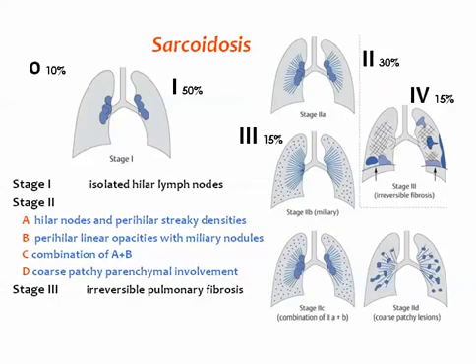Then we came to sarcoid. Sarcoid has many different classifications according to the grades. Some classifications include grade 0, 1, 2, and so on, and other classifications include stage 1, stage 2, A, B, C, and D, then stage 3. Don't bother yourself. If you see lymph nodes only in the chest, bilateral, symmetrical, they are called potato lymph nodes, then you consider this stage 1 sarcoid.